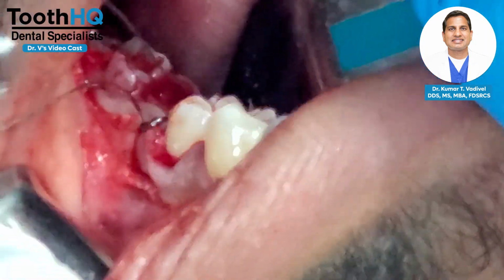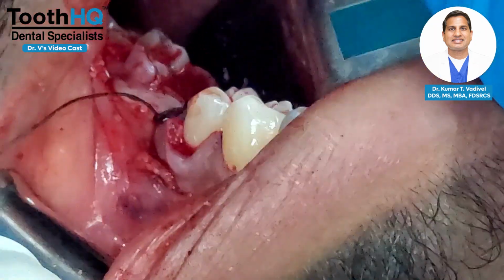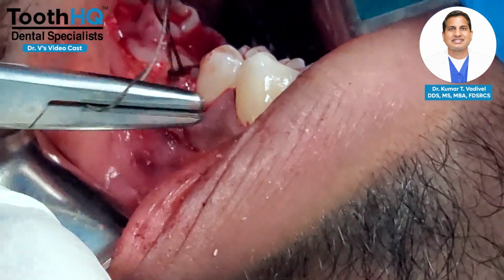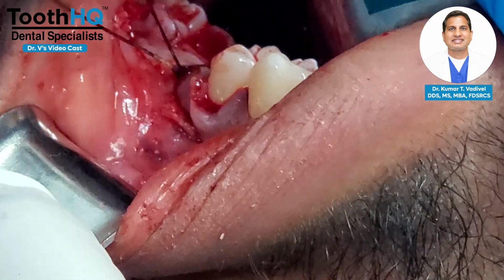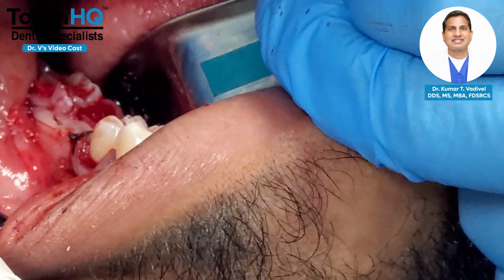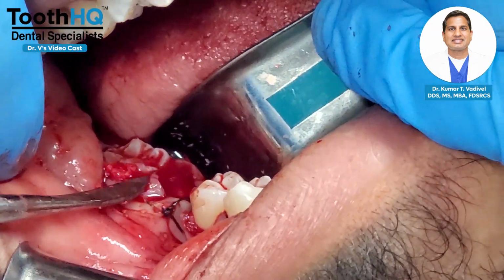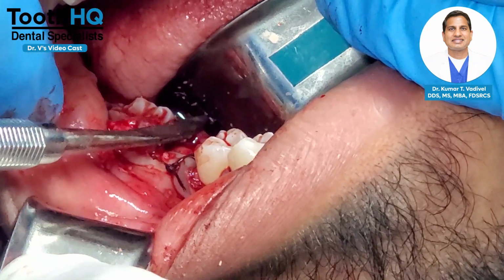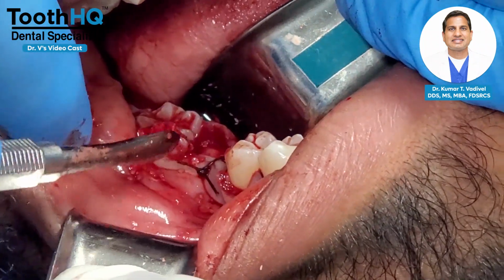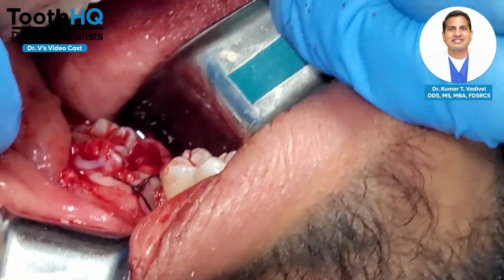So one of the greatest things with the collagen membrane is you can actually leave it open, and you don't have to have a complete primary closure. You're still going to be fine. Okay, cut please. Okay, and you guys can see here, this is the primary closure. I got a very good primary closure, and now I'm just going to finish up with a few more sutures, and then I'll show you after I am done.